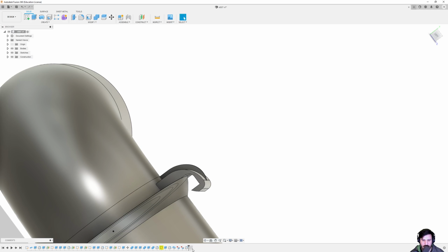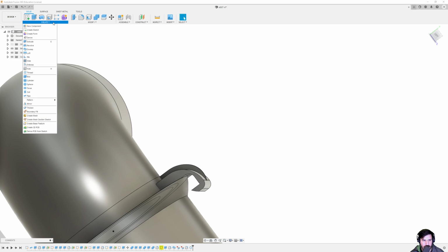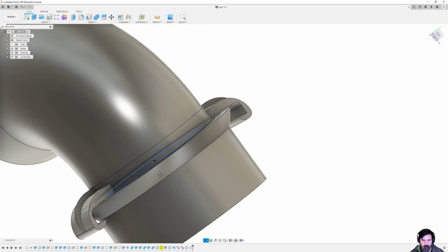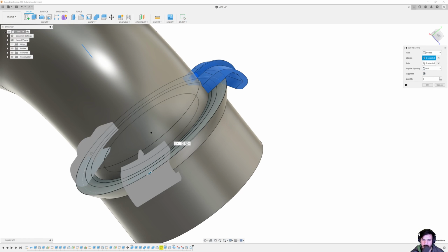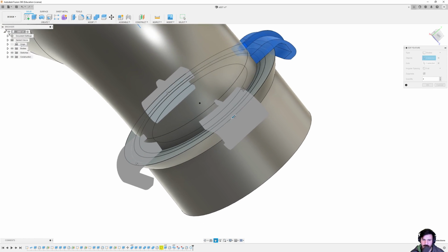And then finally, I did a revolve. I forget what they call it. What is this? Oh boy. Modify. Create pattern. Circular pattern. That's what I did. And so by making that circular pattern, it copied that there. And in fact, if I go in here and I do edit feature, I can turn up the number of those and they should always find themselves in the correct spot.